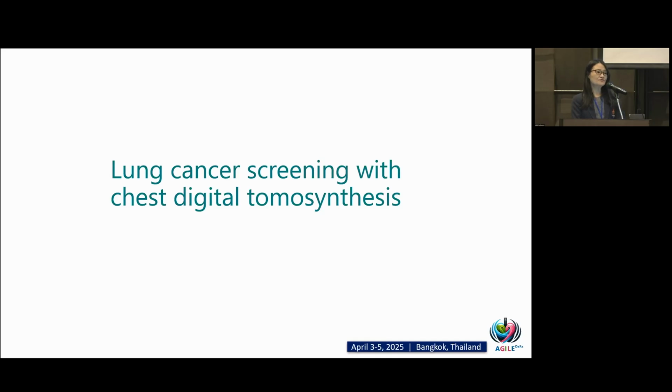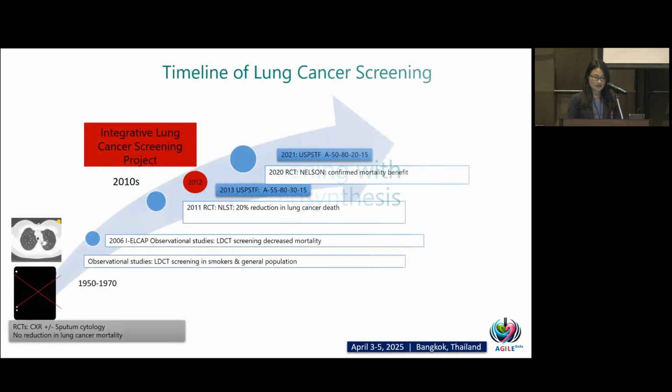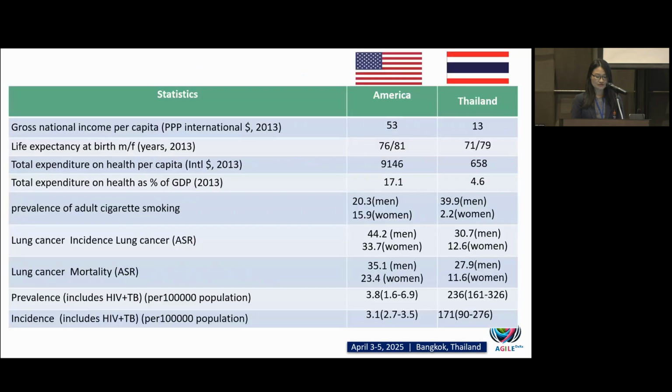Now let's move on to lung cancer screening with chest digital tomosynthesis. Let me share our experience on this one. We launched our integrative cancer screening project in 2012, 1 year after the NLST showed that it can reduce lung cancer mortality. At that time, we compared Thailand and America.